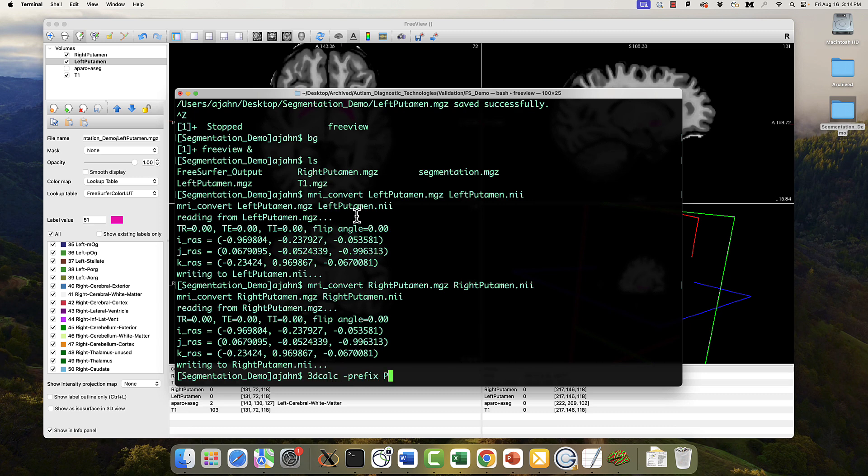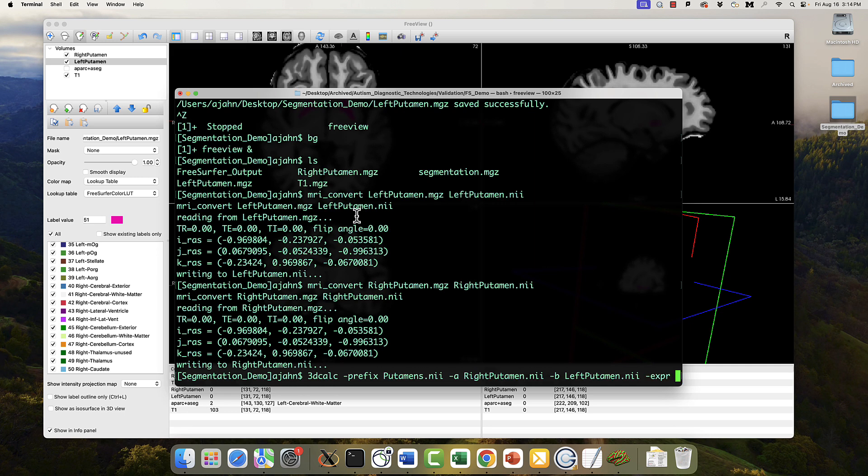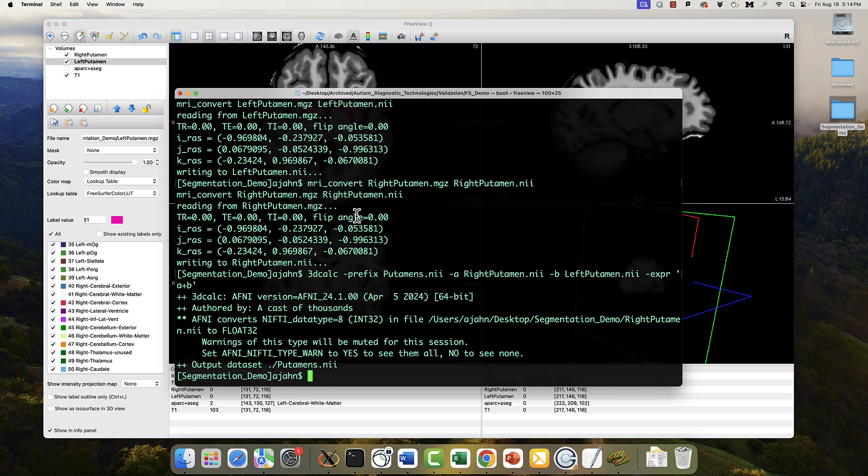In this case, I'm going to use AFNI's 3D calc, because I'm showing you how to use the output from FreeView in a different software package. So this is the code I would use, called the prefix, the output's going to be putamens. I give the arguments of both right putamen, left putamen, and then the mathematical expression is simply add the two together.